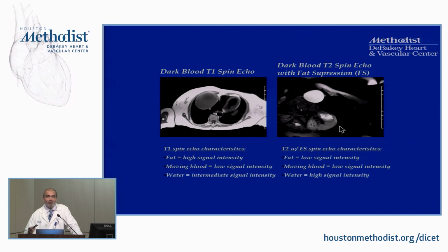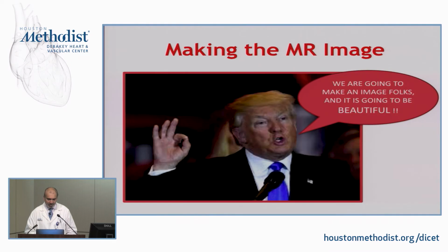Now I could image that same patient, but this time using a T2 weighted pulse sequence, a T2 weighted technique. This will encode high signal for things that have long T2 decay times, and therefore you'll see in this example that fluid within that pericardial cyst now appears very bright. So the key is, if I show you an MR image and ask what tissue we're looking at, you really need to know what type of imaging sequence it is, because just knowing it's bright or dark doesn't help you unless you know what kind of imaging sequence was utilized to generate that image.